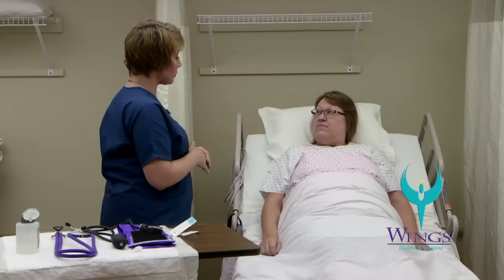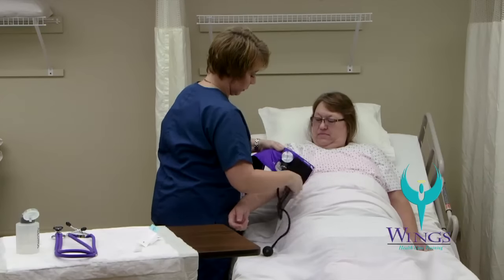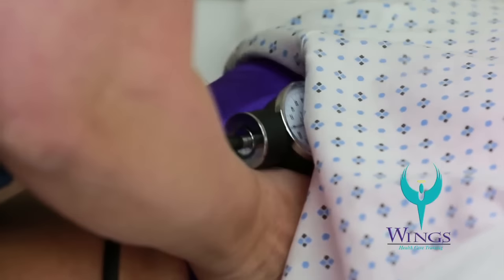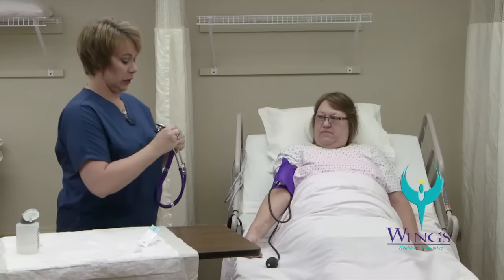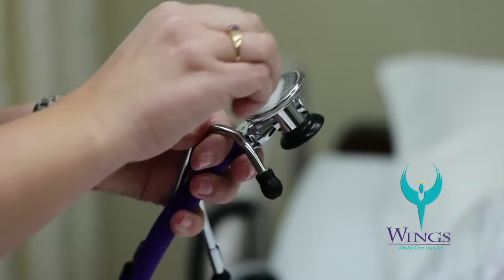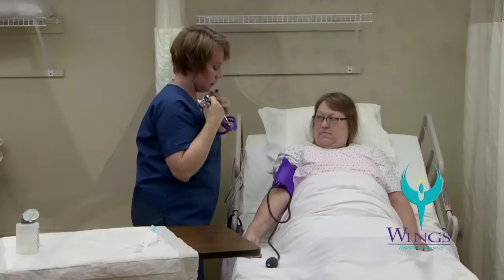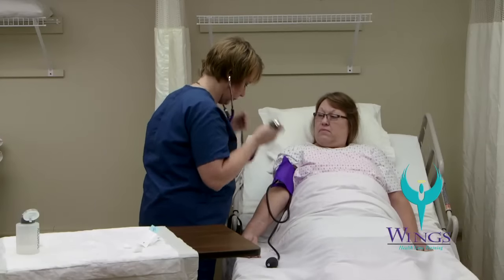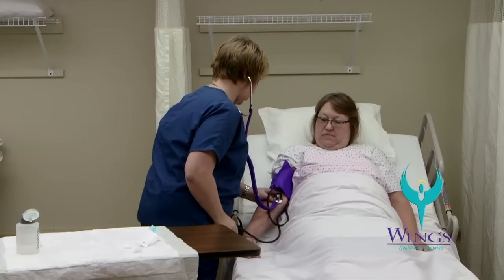The next thing that I'm going to do is obtain your blood pressure. I'm going to place the blood pressure cuff above the crease in the arm with a marking over the inside part of the arm. I want to make sure that the blood pressure cuff is snug and secure. I'm going to use the stethoscope — the first thing I want to do is clean the ear pieces with an alcohol wipe and the head of the stethoscope. The stethoscope is placed on the inner part of the arm along the crease so that it's over the artery. I'm going to pump the blood pressure cuff up to approximately 180 millimeters of mercury and listen carefully.